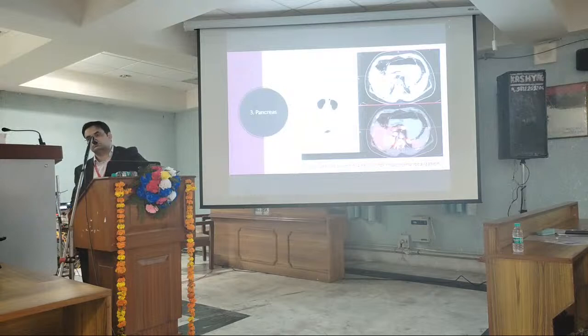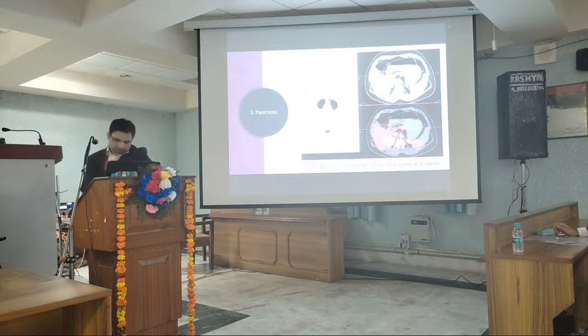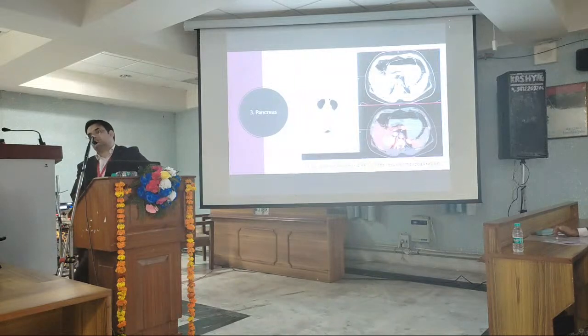So in practice, when you find a challenging case, then these modalities can come into play. If you have a clear-cut focal lesion, like in this case, you are rightly saying that you may not need any extra effort to go ahead. But if you have operated and it is still persisting, or in a recurrent setting, we recently had a case in which the patient had persistent as well as recurrent hypoglycemia after surgery for insulinoma. So those are also good settings for these scans.